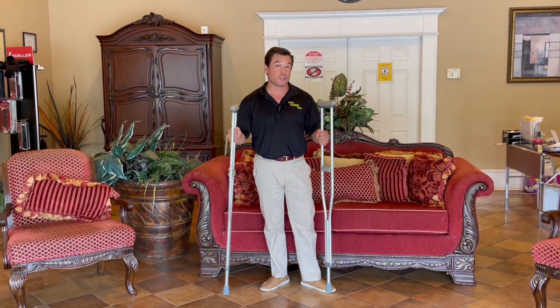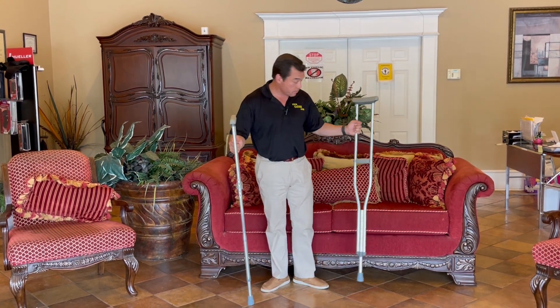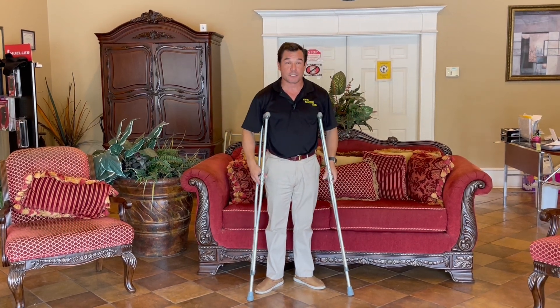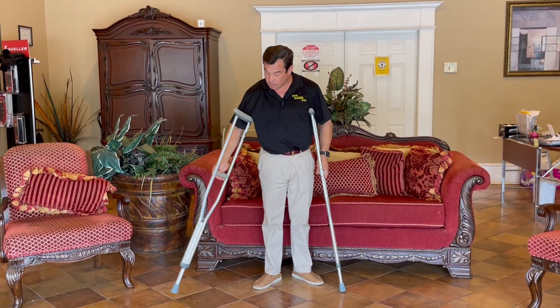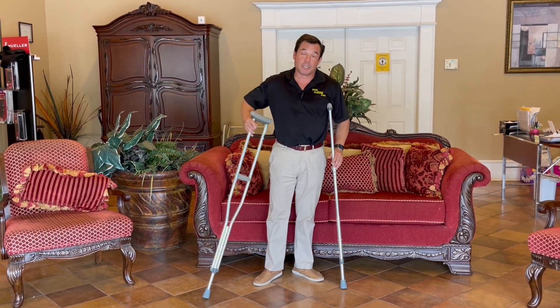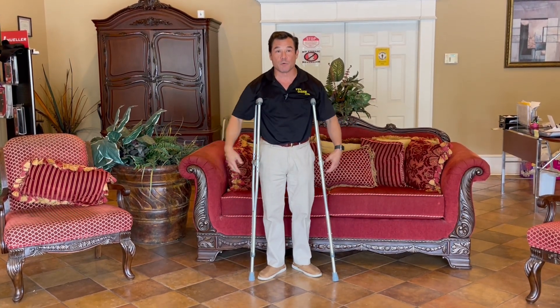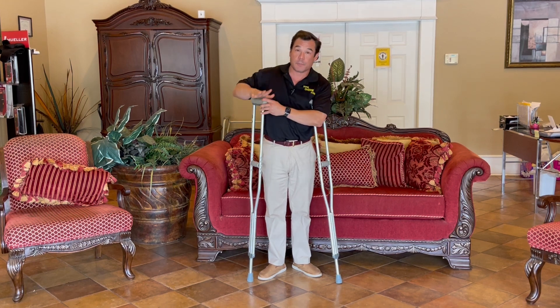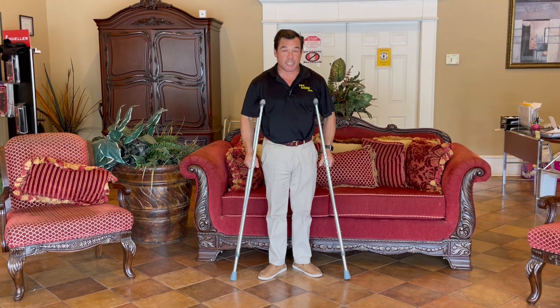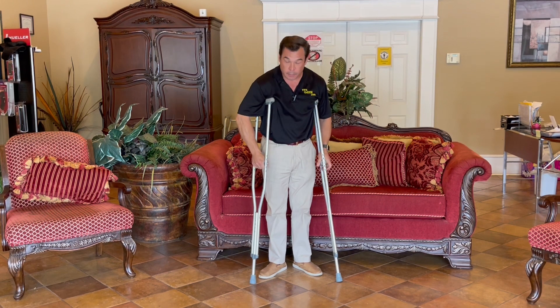Today we're going to show you how to use these properly and how to set them to the proper height. To walk with the crutch, they are put under the arms and you rest your hands on the handpiece. What most people don't do — and why you hear a lot of complaints about crutches making people's armpits sore — is because they're putting their whole body weight on the crutch up here. That's not how these are to be used. That is just to hold them in place, but your main focus of where you want to put your weight is on the hands on the hand grip.